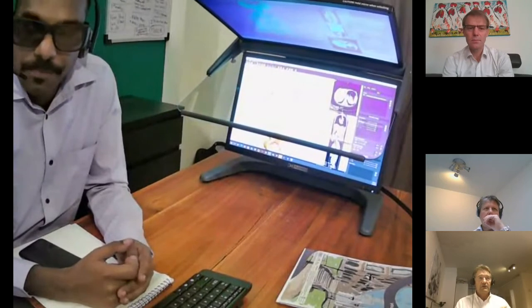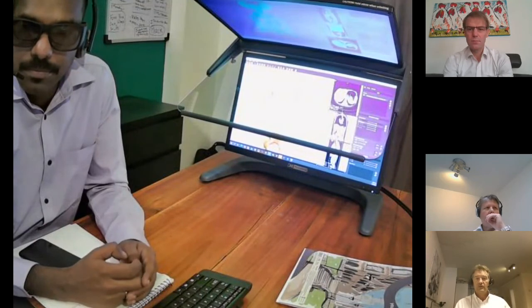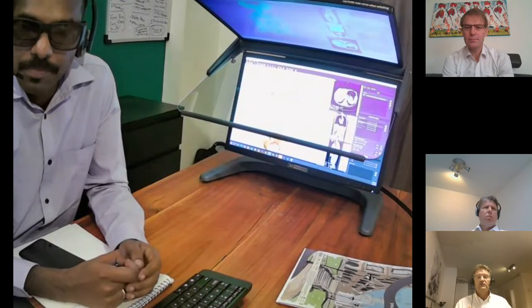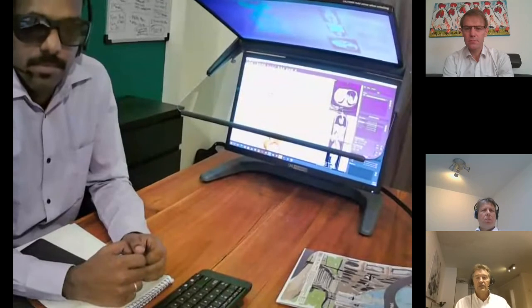So don't get us wrong. Vesalius 3D is available on every laptop. You can use your own laptop, so a regular 2D screen. You can use Vesalius 3D on a VR station like the VR PluraView.